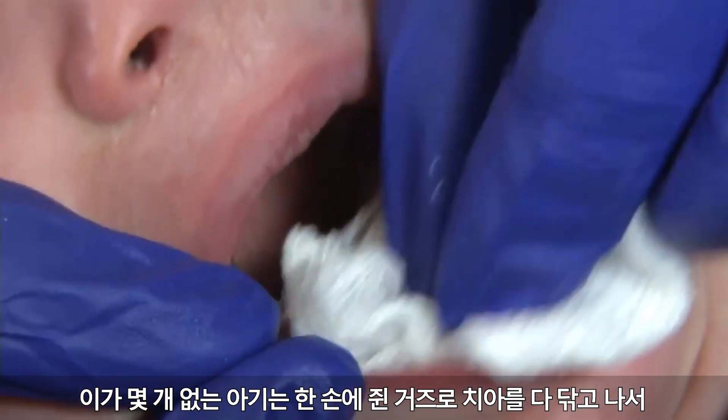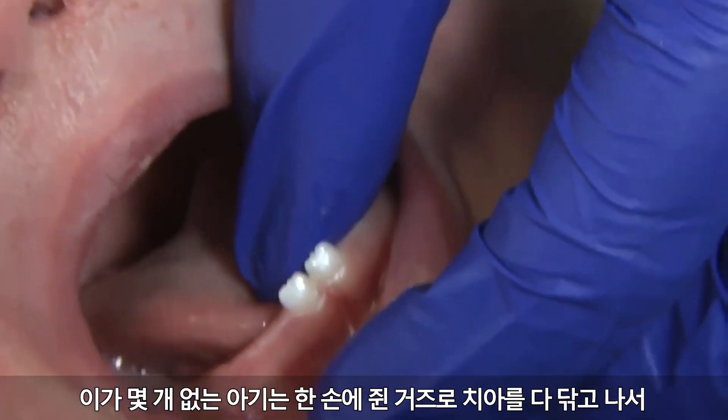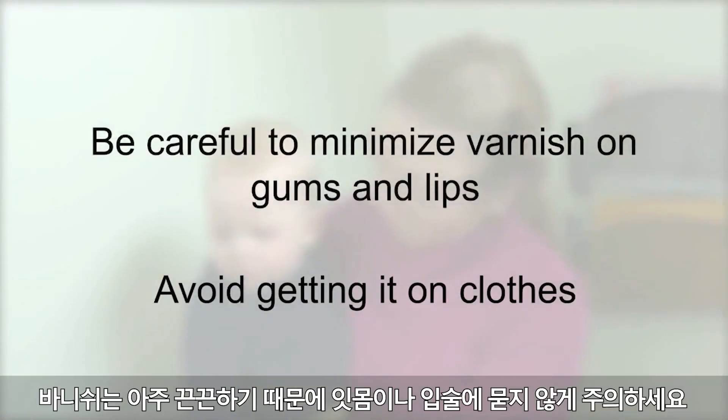For a child with only a few teeth, use your other hand to dry all of the teeth with the gauze, then apply the varnish. Do your best to paint all surfaces of the teeth. Be careful to minimize varnish on gums and lips, as it is very sticky.